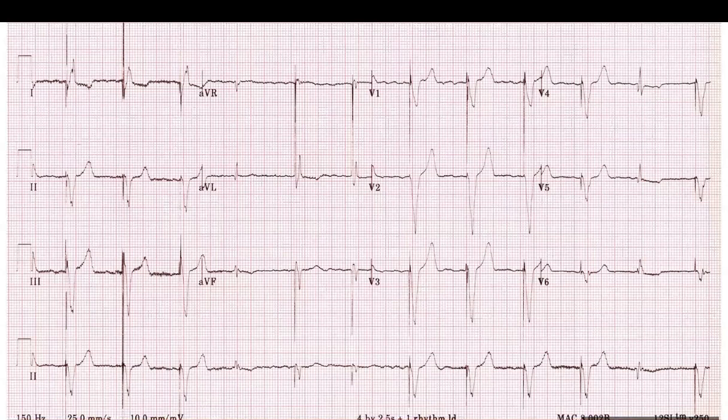So the idea in general is we want to minimize ventricular pacing. So you could try lowering the rate a little bit to avoid fusion, to avoid unnecessary pacing. But otherwise, not really. There is no danger from it, because you have normal capture, normal sensing, and there's no other kind of abnormality here. So I wouldn't worry about it.